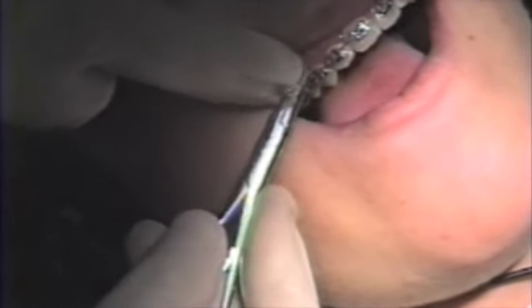The main use of this tie is with rectangular wire, where the rectangular edge of that wire needs to be placed very tightly against the slot edge.